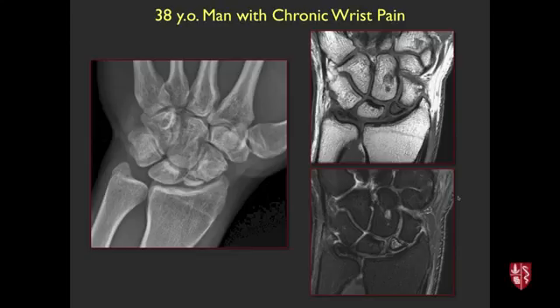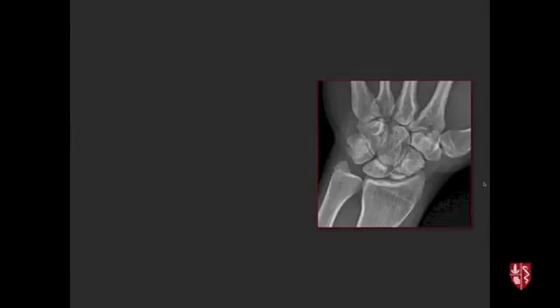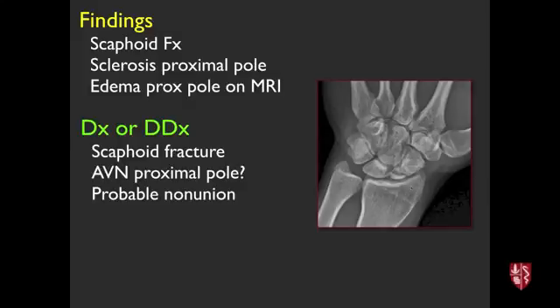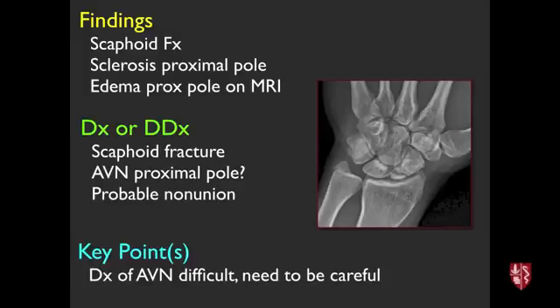Next case, 38-year-old with chronic wrist pain. There's sclerosis within the proximal pole of the scaphoid, a lucent line indicating a fracture, and edema in the proximal pole on MRI. This is a scaphoid fracture — probably a nonunion given the chronic appearance. The proximal pole sclerosis may represent AVN. IV contrast can help assess vascularity: if the bone enhances, there may still be enough vascularity to allow healing with surgery, whereas true AVN means the bone cannot heal.